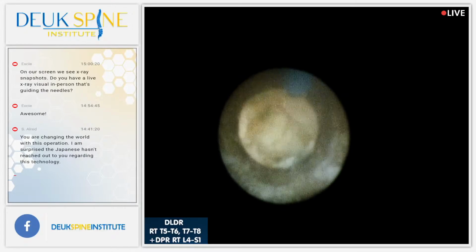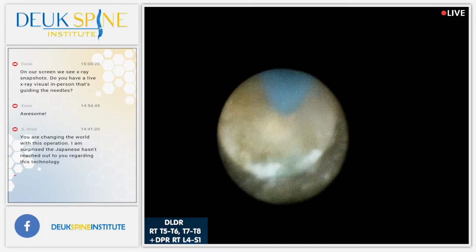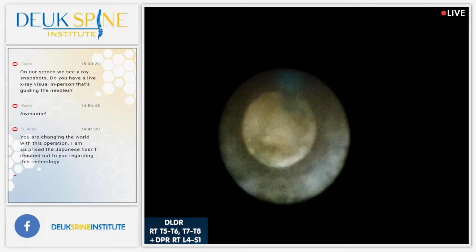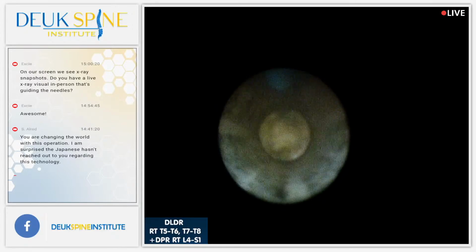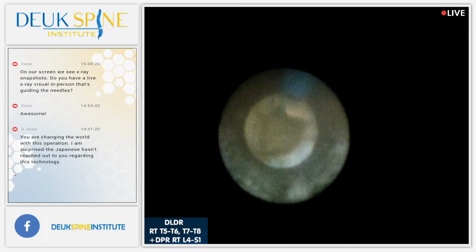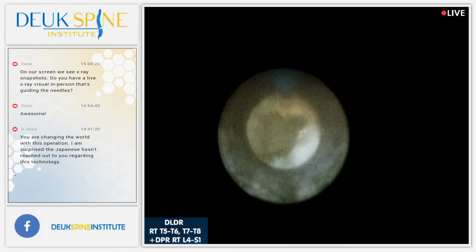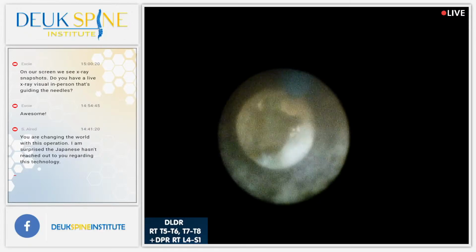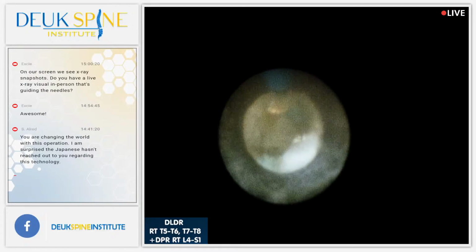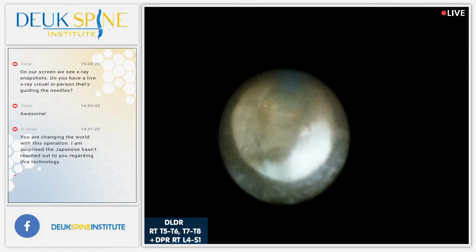So remember, some of my goals during surgery is I want to get the information I need, but I also don't want to overexpose the patient, or my staff in the operating room, or myself for that matter, to any unnecessary risk from radiation. Taking stills is much better than continuous video shots, which are unnecessary. You just need snapshots as waypoints.